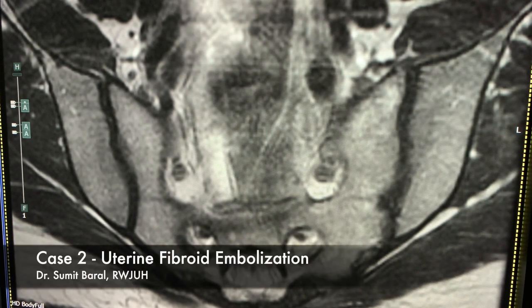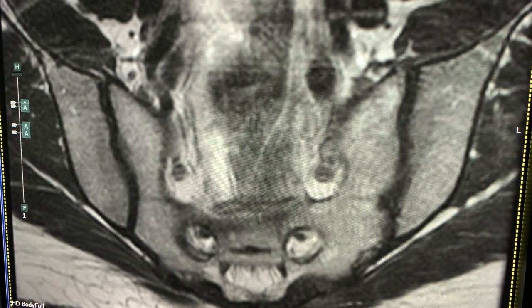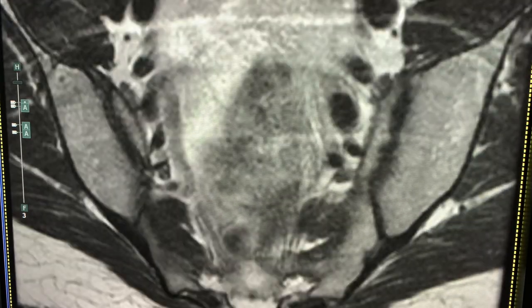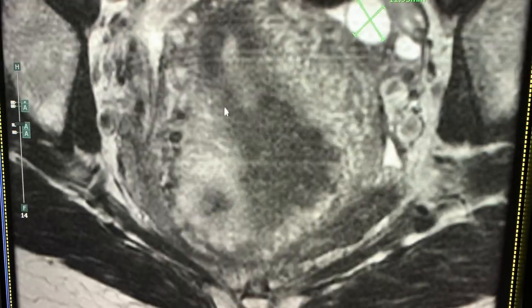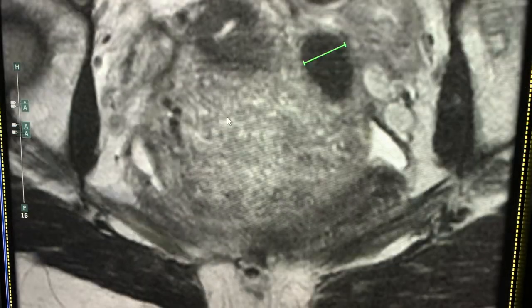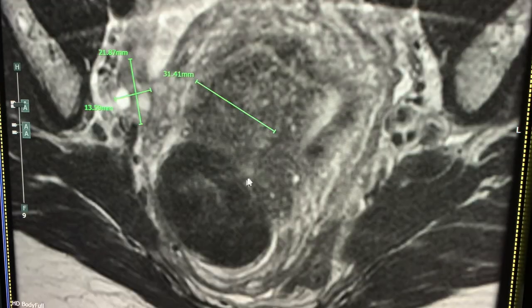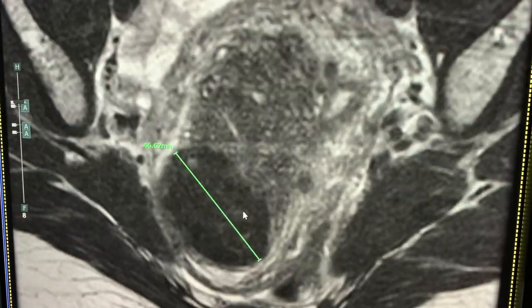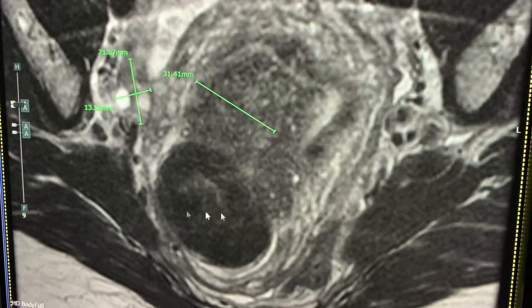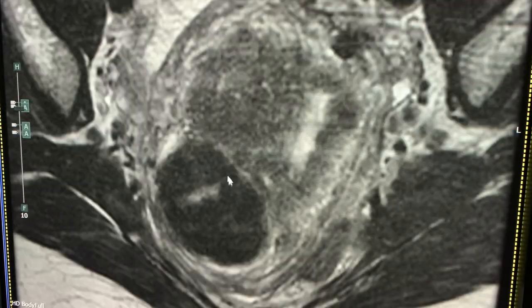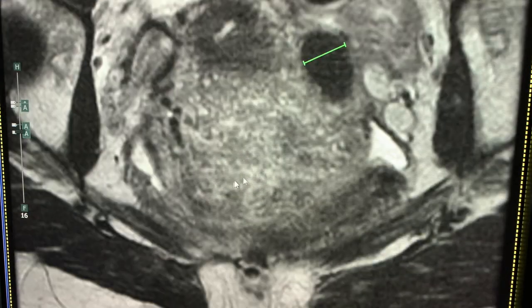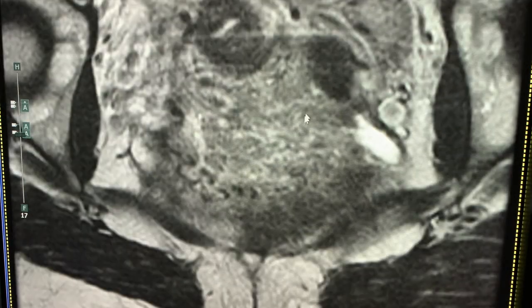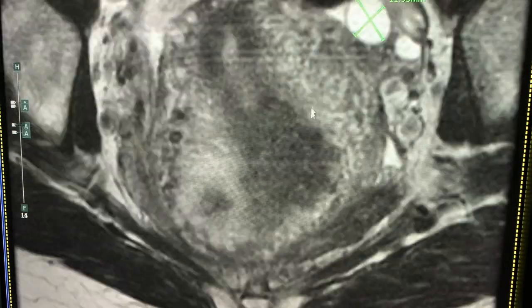This is the pelvic MRI of a 43-year-old female who has symptomatic uterine fibroids. As we scroll down, you can see that this is the uterus — it's very enlarged and abnormal appearing. There are several masses. She has a dominant fibroid here on the right and a few smaller ones on the left.